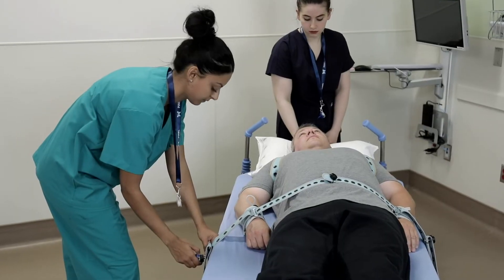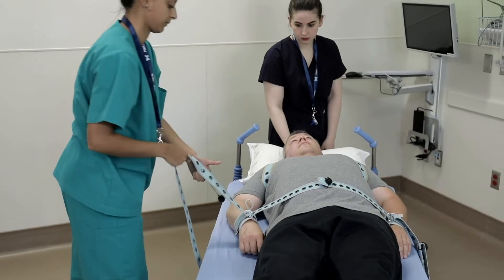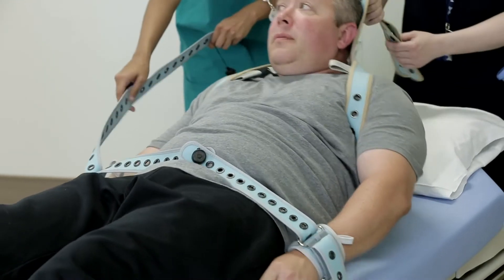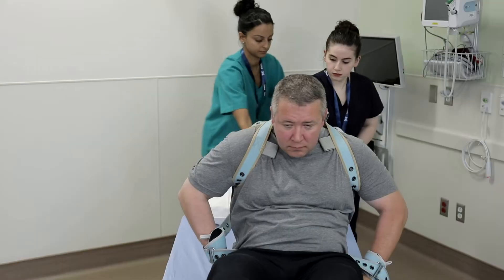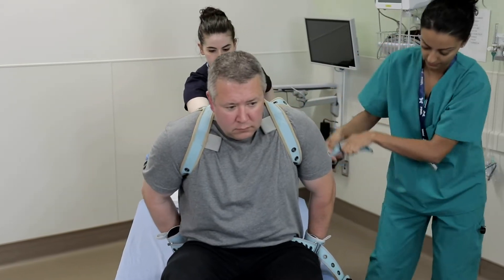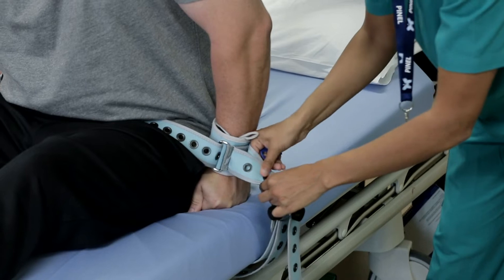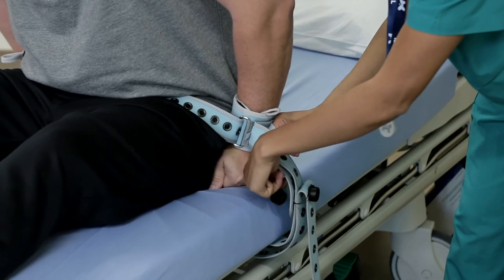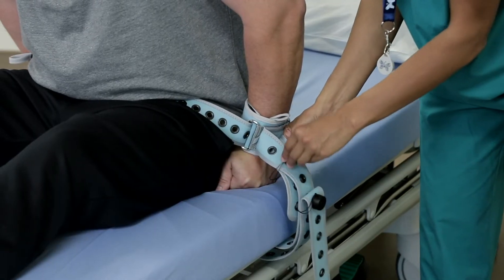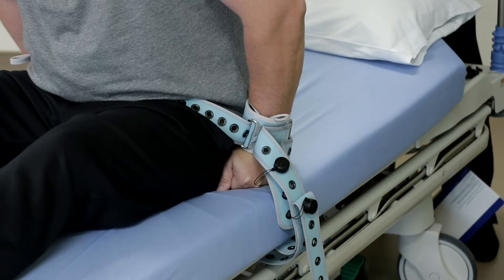From the seven-point position, detach one side of the wrist-limb belt from the bed frame. This strap is held securely so that the arm can be quickly pulled back to prevent the arm from striking. Then pass the long strap behind the patient and through the buckle located on the other side of the wrist. Pull this strap tightly and insert a button and pin. Remember, when you are in a position opposite the arm that is being released, you are within strike range of the released arm. The encircled wrists are now firmly secured.